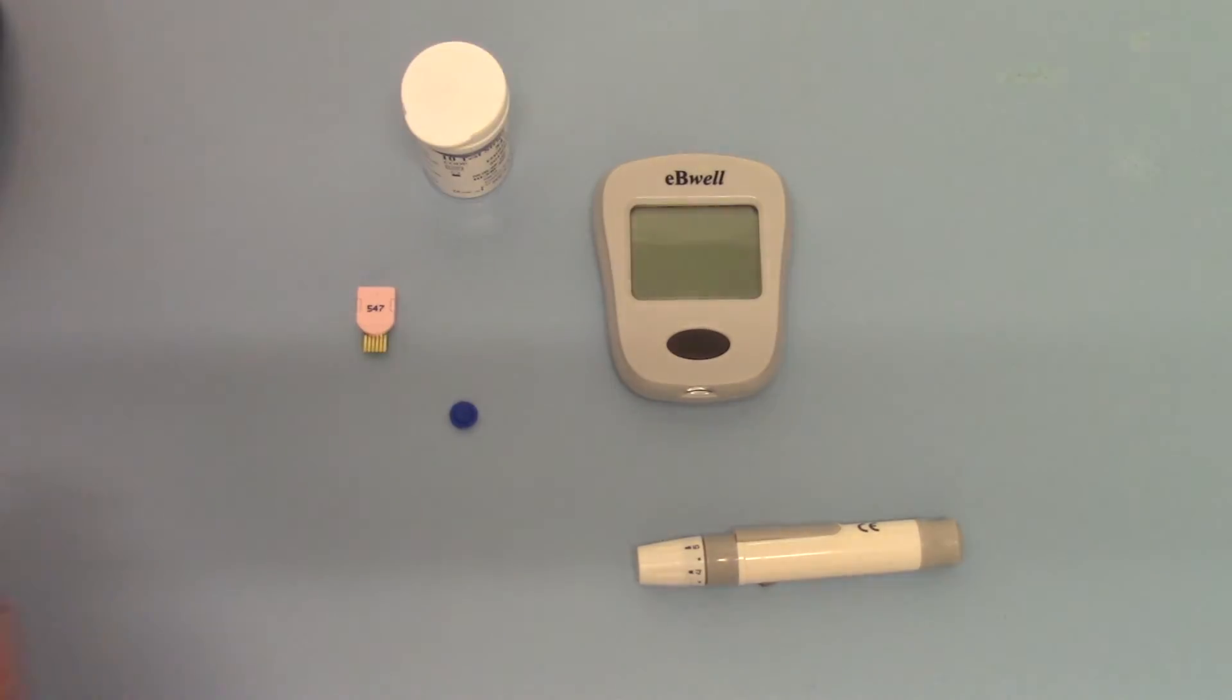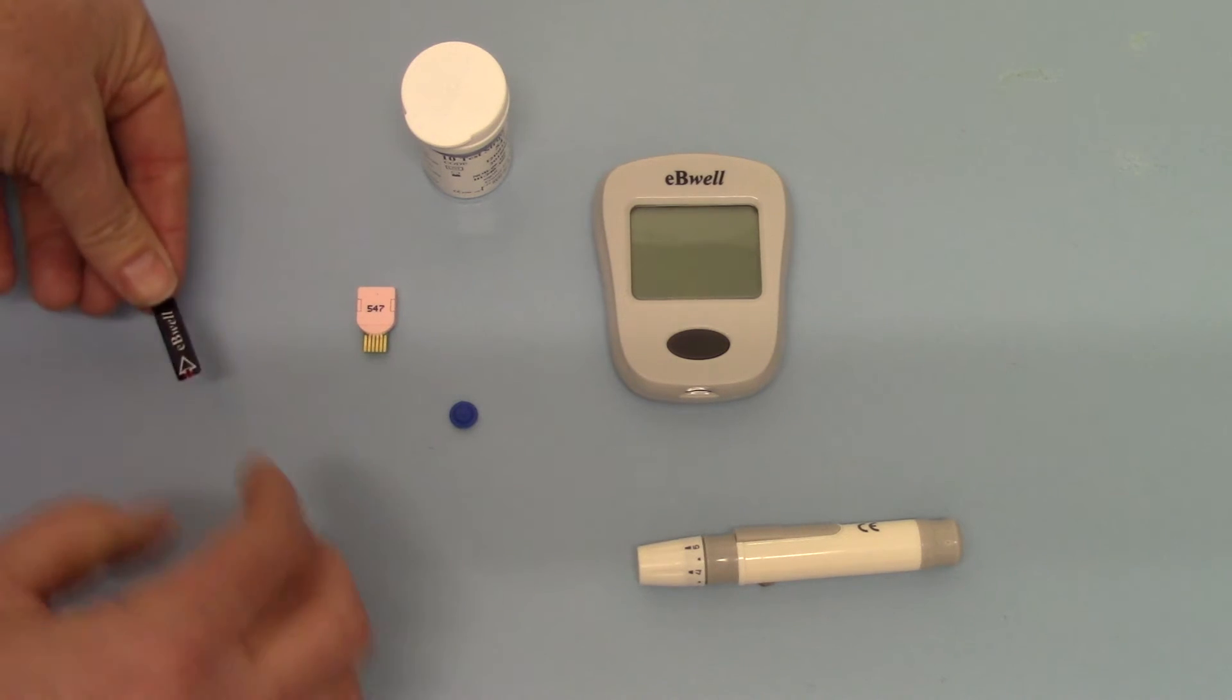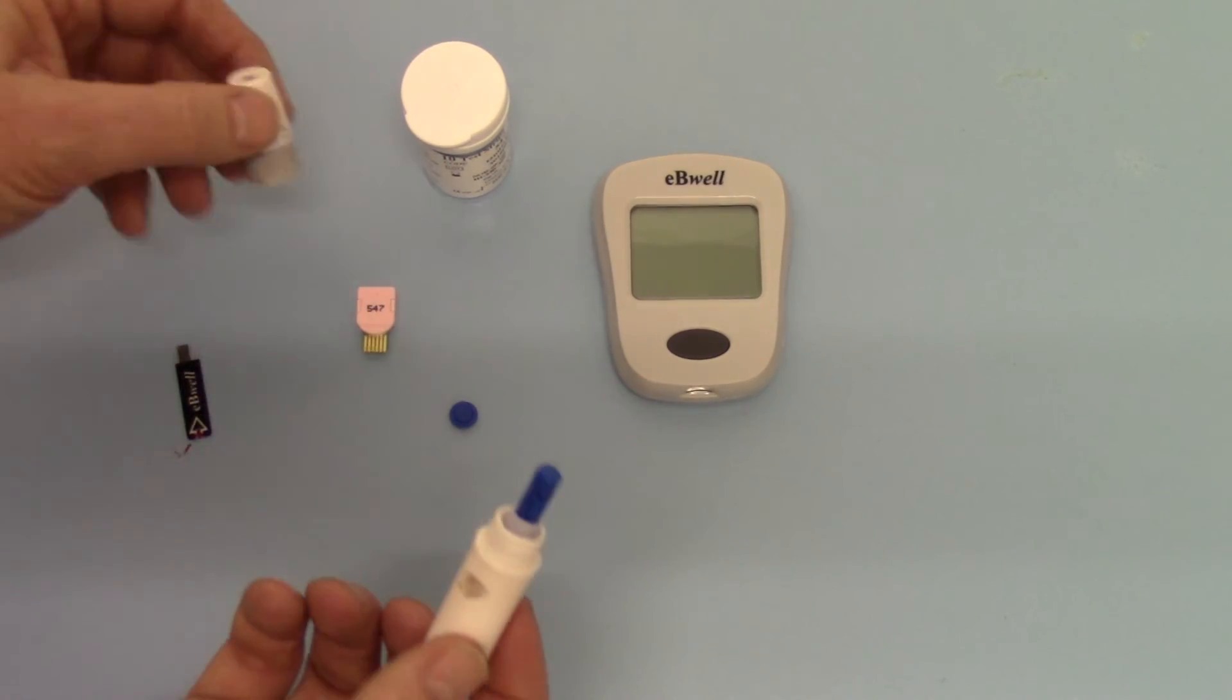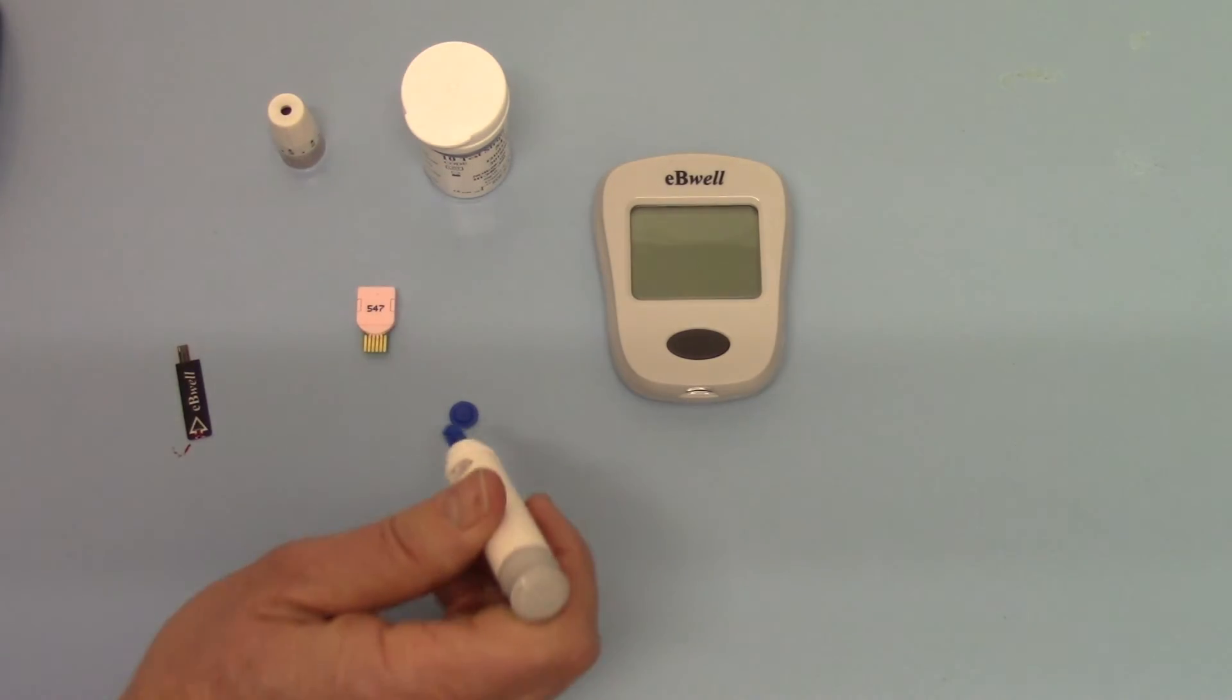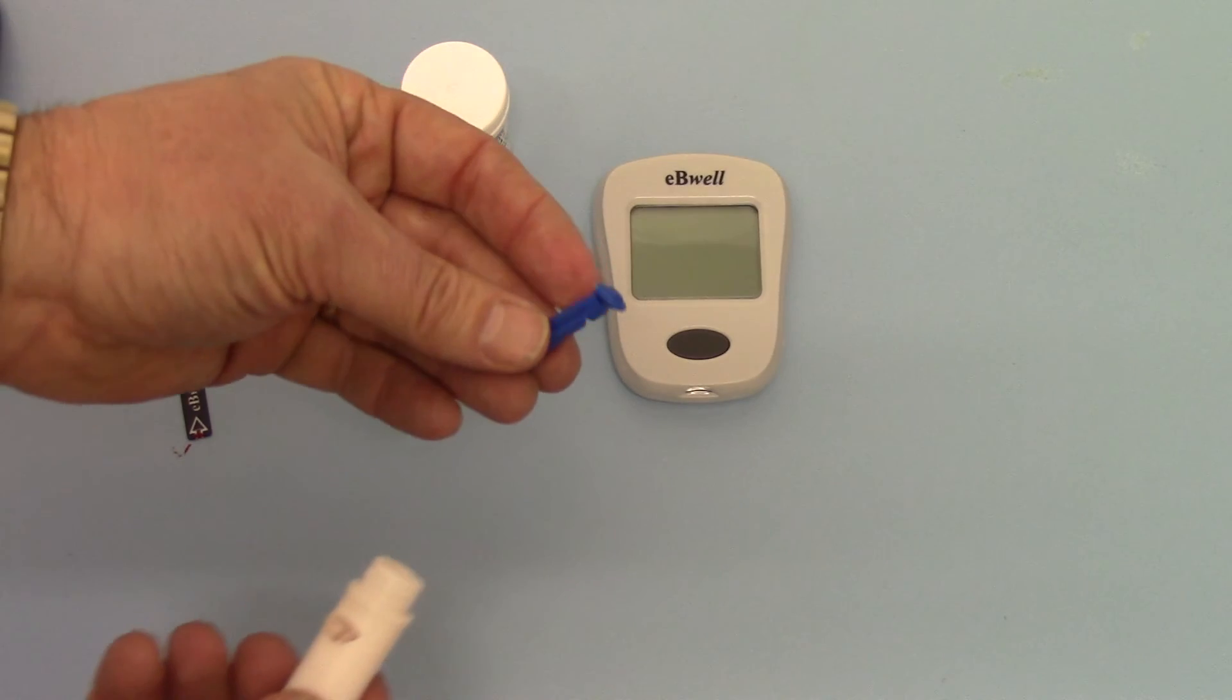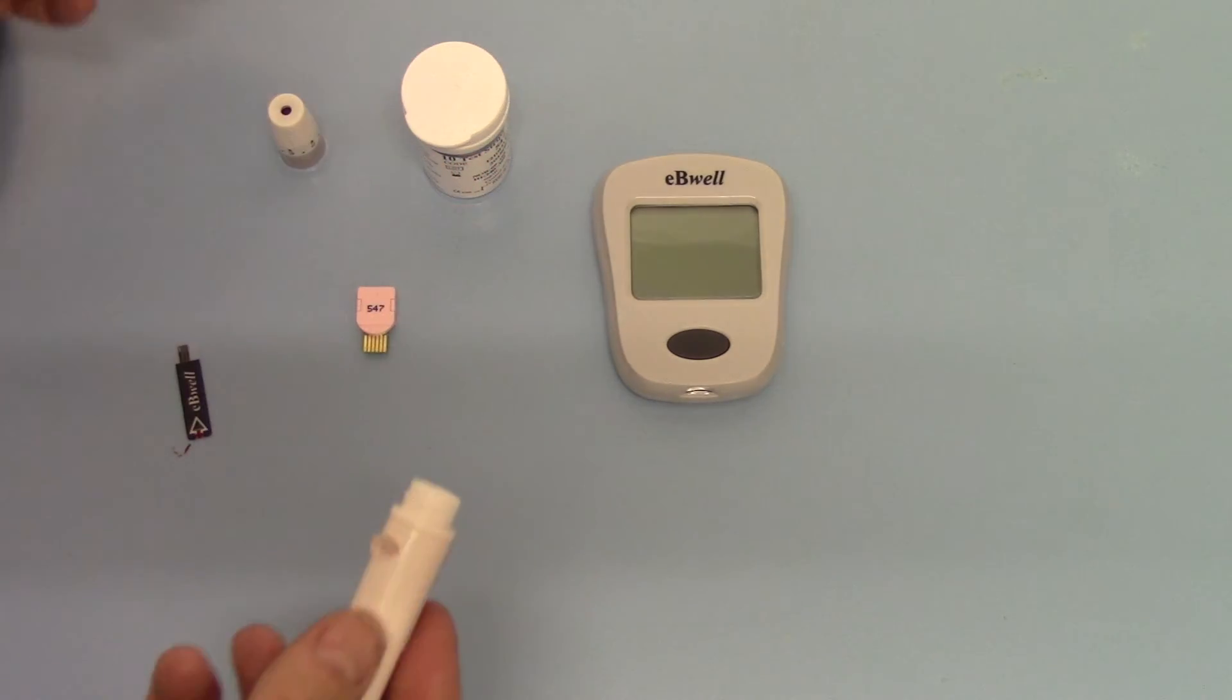The meter powers off instantaneously saving battery power and then to remove the lance from the lancing device, if we just unscrew this, push it into the cover, the lance can be safely removed and disposed of.